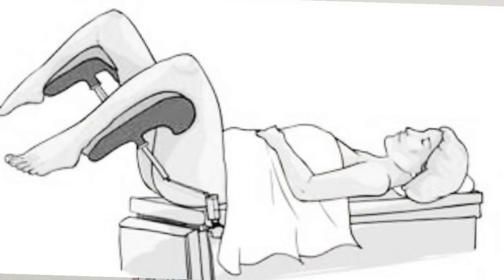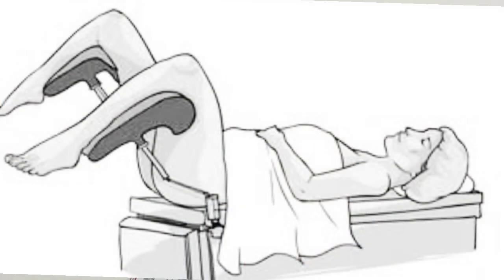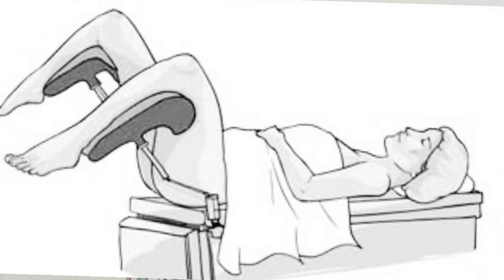For the procedure, first ask the patient to empty her bladder. Then position her on the table in the modified lithotomy position with stirrups, placing the buttocks slightly over the edge to facilitate easy speculum insertion. After inserting the speculum, take a good look at the cervix and the vaginal fornices.